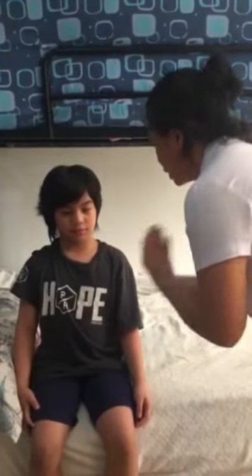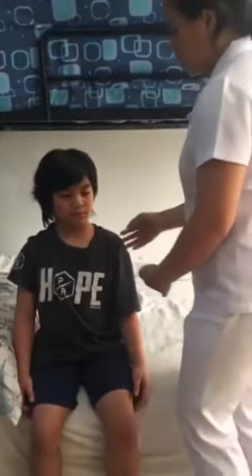This will help to balance or lower your blood glucose level, okay? And I will be placing you in a supine position, exposing your abdomen, and that will be the site where I will administer your medication. Is it okay, sir? Yes. Alright. So I'll be placing my patient and maintaining my body mechanics all the time.